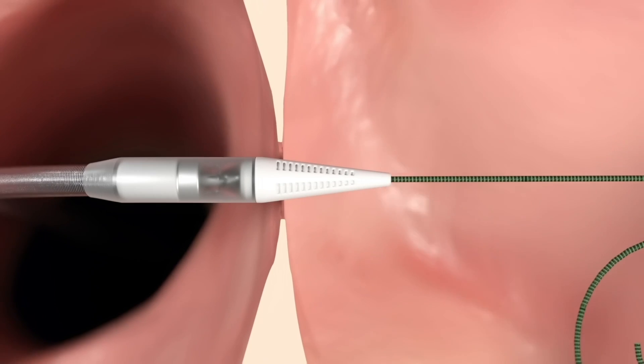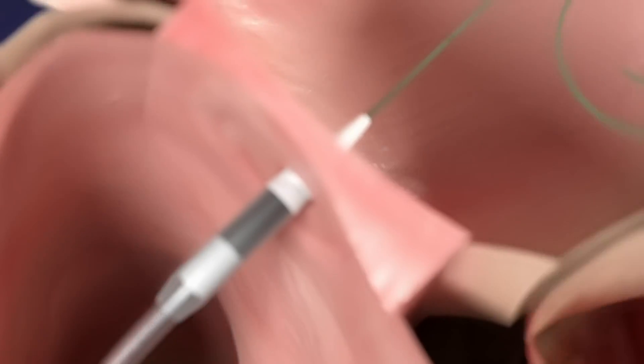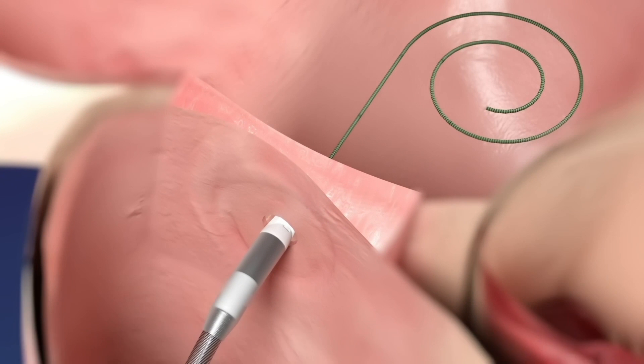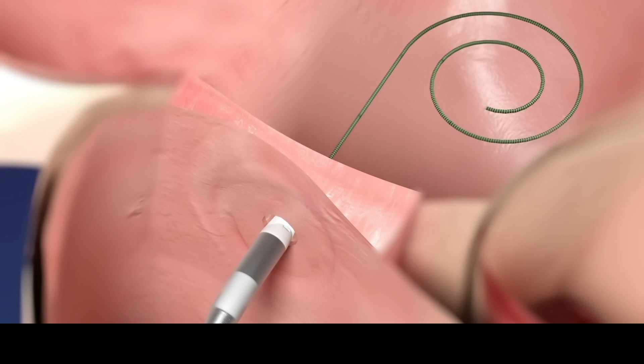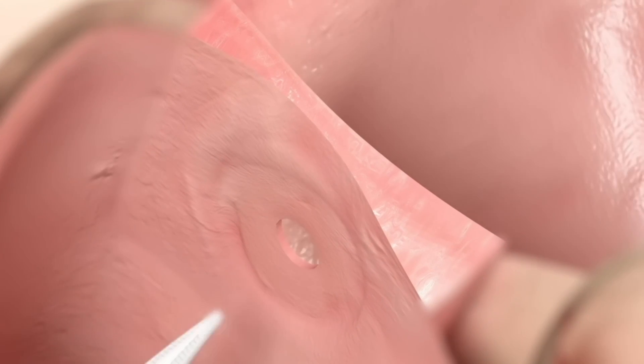A short pulse of energy is applied to cut the tissue, resulting in the controlled creation of a durable passageway between the left and right atrium, called an interatrial shunt. The guide wire and device are then removed as a unit from the body, leaving nothing behind.